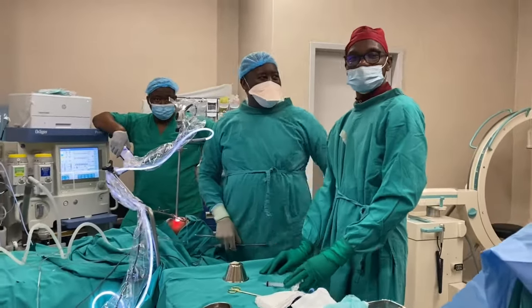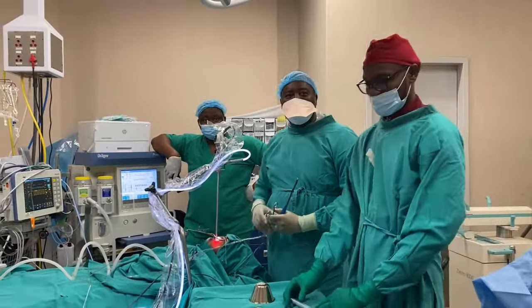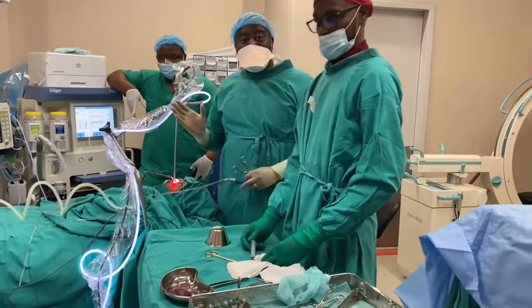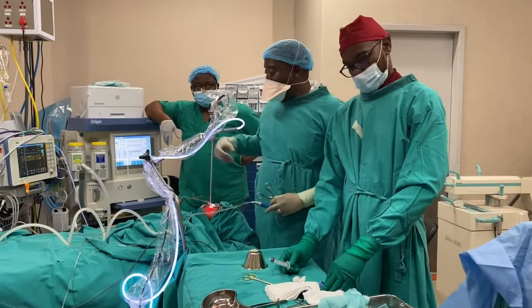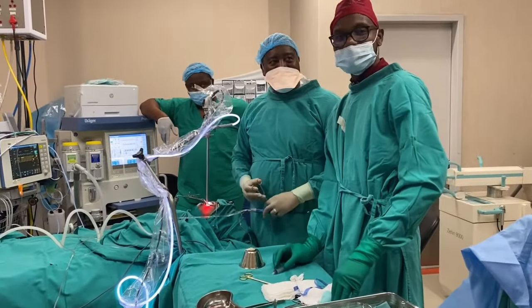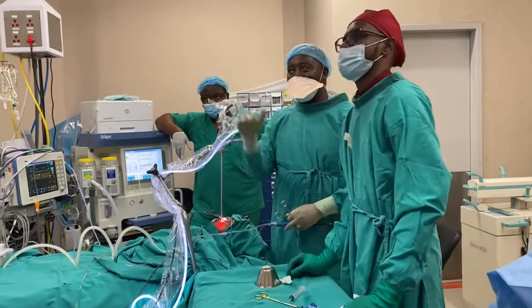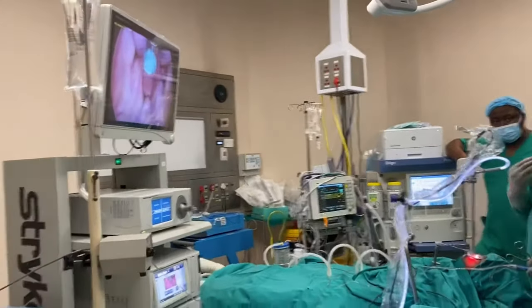Hi, my name is Dr. Mareka and this is Sadiqi. This is Dr. Ramunyai and behind the camera, it's Reina. Today we are going to do endoscopic adenotonsillectomy. We are going to use the arm that you see there attached to the bed. It's a new arm that MedLab has bought specifically for these cases to make it nicer — we look at the screen, we don't look down and strain our necks.